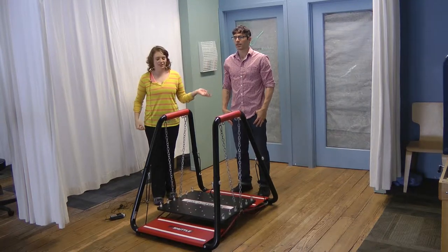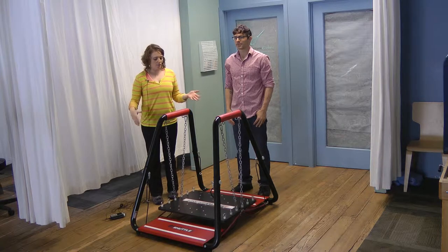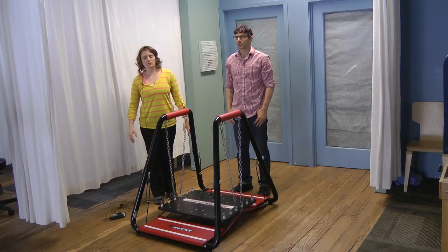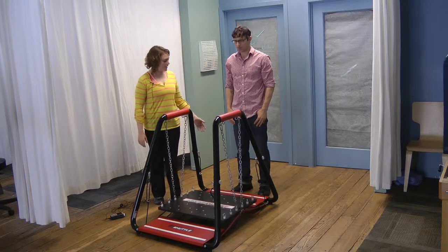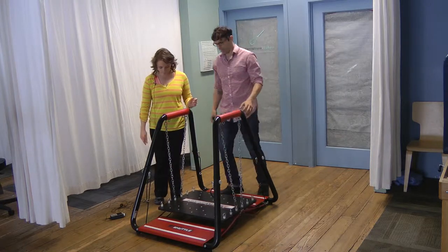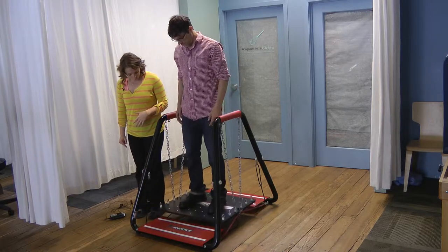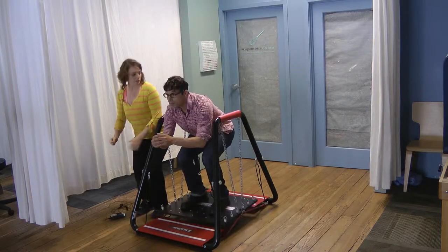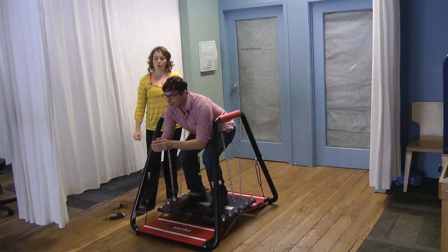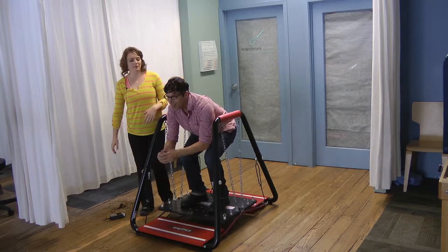I'm Ashley, and this is Jake. We're here at Presidio Sport and Medicine in San Francisco. One of the things I use this shuttle bounce for is a quad strengthening series we call the VMO circuit. First, he's going to come up and step up on here, putting his feet in between the four and the eight. Then he's going to drop down and just hold a squat for as long as I tell him. That's part one of the VMO circuit.